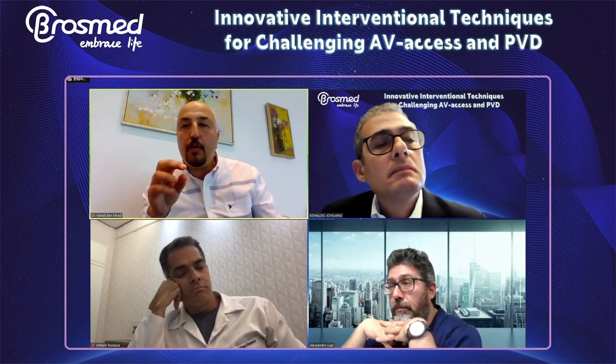Honestly, we prefer to use a drug-eluting balloon. We have such a device. We use it if you have a young patient, less than 50 years old, or a diabetic patient, because it's very expensive in Tunisia, and in case of restenosis. But in the case with that result, it is the first-time angioplasty. I prefer to use a plain, normal balloon, and if I have a dissection, I put a stent, and if there is restenosis, I put a drug balloon a second time.